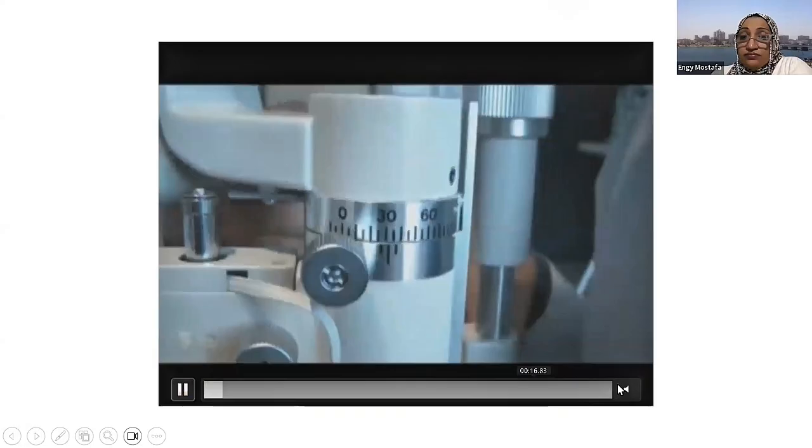Here's again a picture, a video of the optical section, and here are the KPs. Can you see the KPs on the back of the cornea? Here are the KPs. What we are seeing with the optical section is all the layers of the cornea.